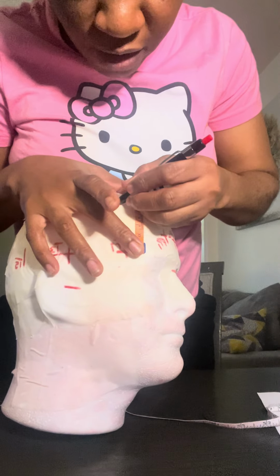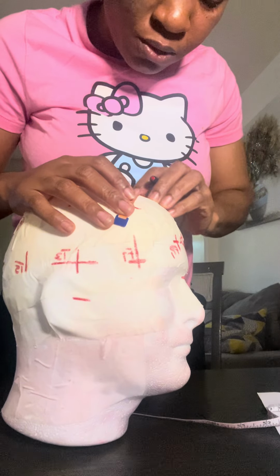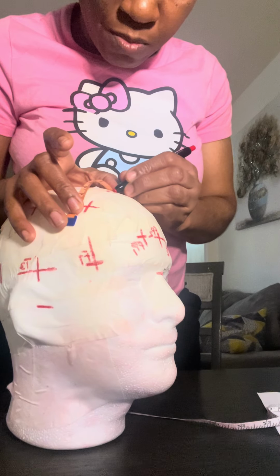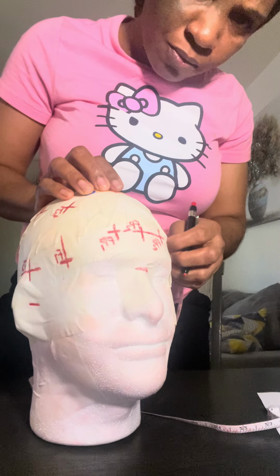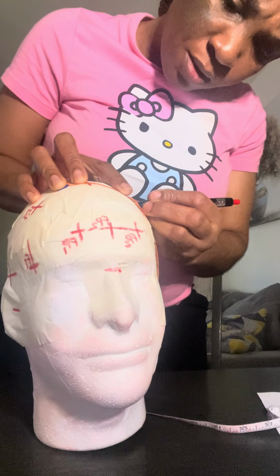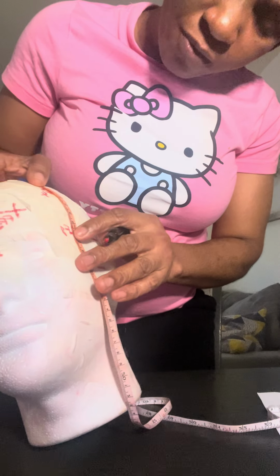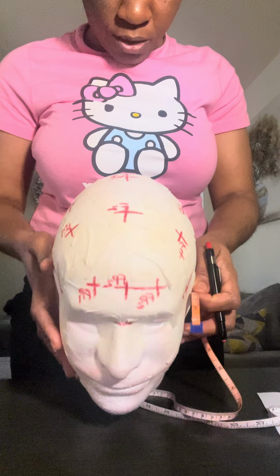This will give me my true F3. Okay, from my true F3, 0 mark, going through FZ, 5.5. This will give me my true FZ. From my true FZ going down 5.5, this will give me my true F4. From my true F4, you can see the same 5.5 to my F8. So I'm done with my anterior measurements.